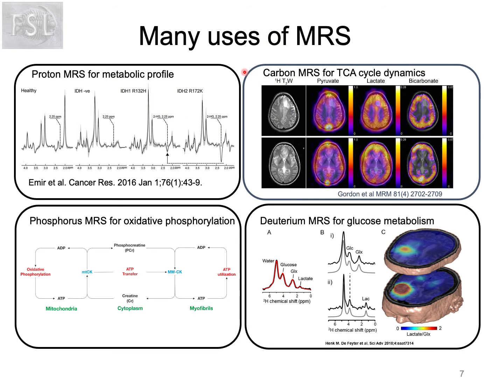So proton MRS can give us detailed information about metabolite concentrations in the target area. This, for example, can provide both sensitive phenotyping of diseases and monitoring of physiological changes arising from brain plasticity. But alongside this static metabolic profile, other types of spectroscopy are available. Recently, work combining proton MRS with diffusion is revealing cell-type specific measures of microstructure, or by looking at carbon atoms, phosphorus atoms, or using an exogenous tracer such as deuterium, we can measure dynamic aspects of metabolism.